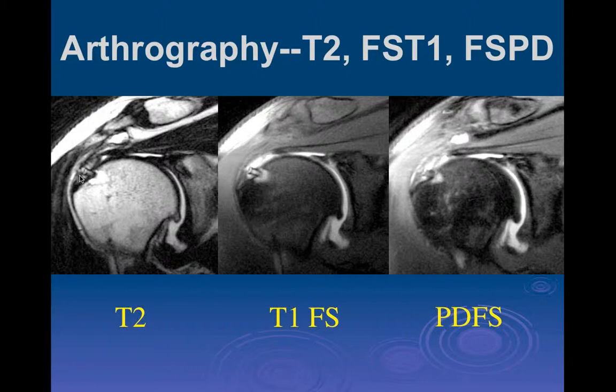But it's not a perfectly normal tendon, in that there are post-surgical changes or partial tears or whatnot there, correct? There's never a normal tendon after surgery. Perfection is in the mind of the beholder. So from the surgeon, it's perfect.